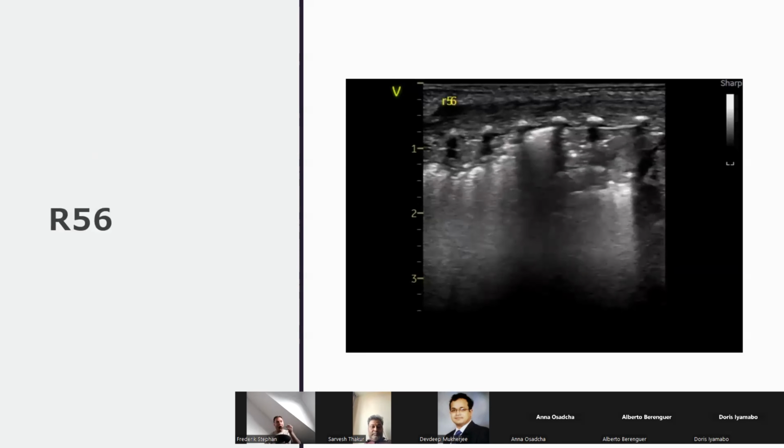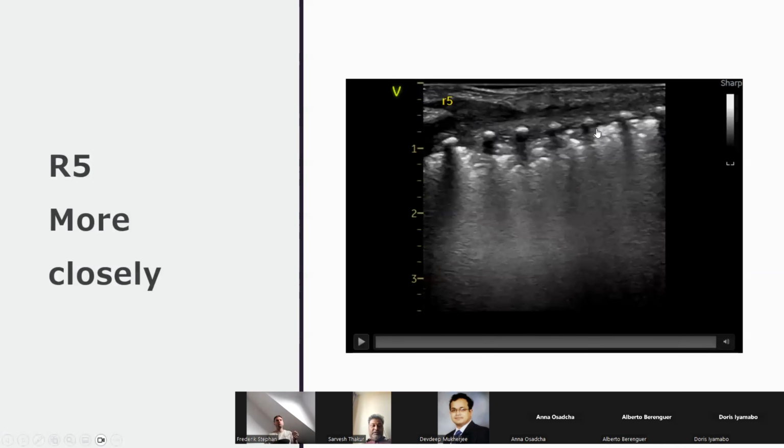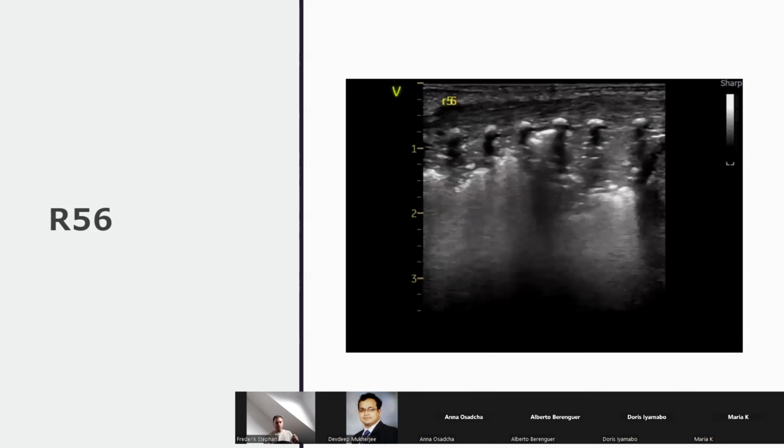And lovely. What is this, a superficial area? So, like, what is that in the muscles? Yeah, over like here. At the moment, what I'd like to say is it's not subcutaneous emphysema. Okay, probably just a little bit of muscle artifact. So just to reassure you. But this is our 6 near the liver.